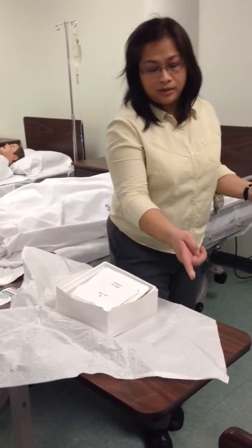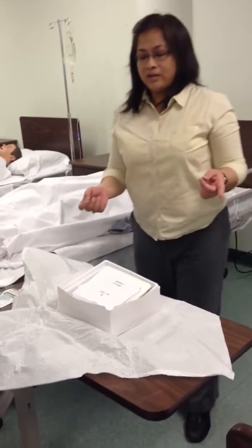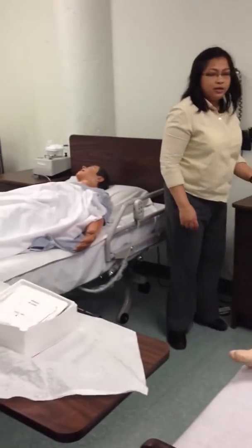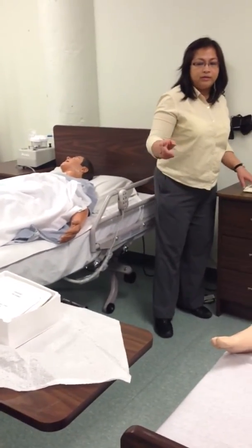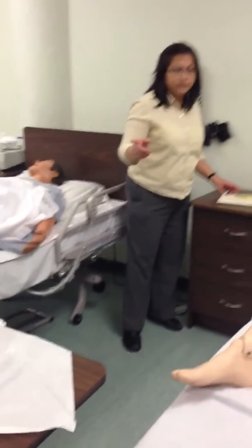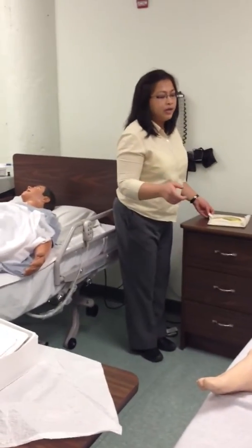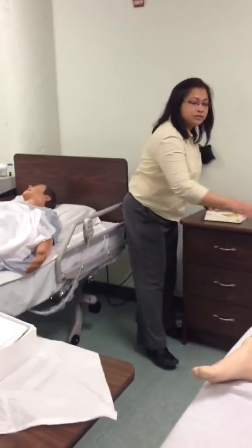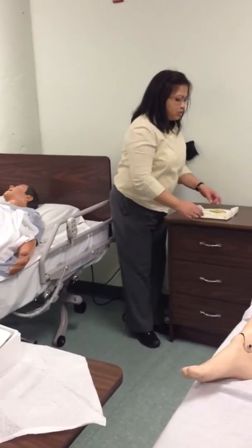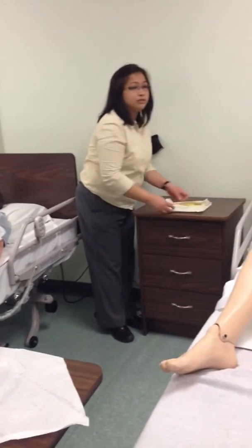Do not, you see that? Something is falling. That's contaminated already. So from there, you're gonna go sideways to your sterile gloves. And verbalize to the teacher, I'm checking the sterile field, all right? The sterile field and the patient, all right? If the side rails is really, really long, you have to put that down also. Okay, so putting the sterile gloves is part of the test.